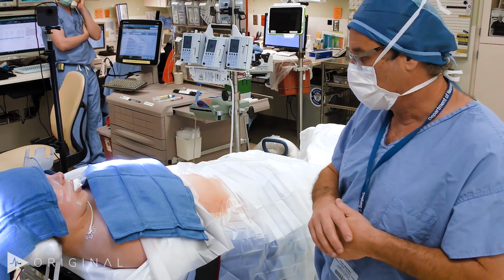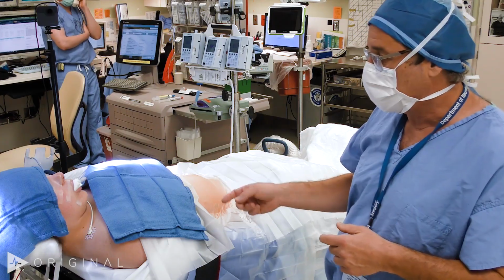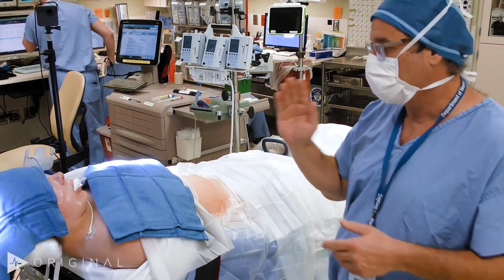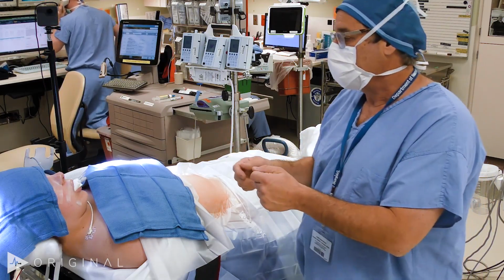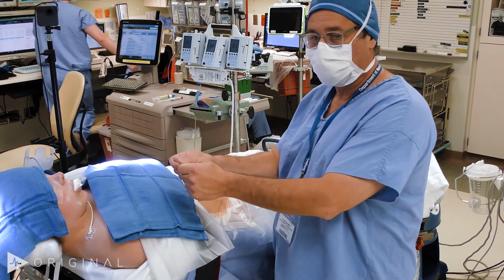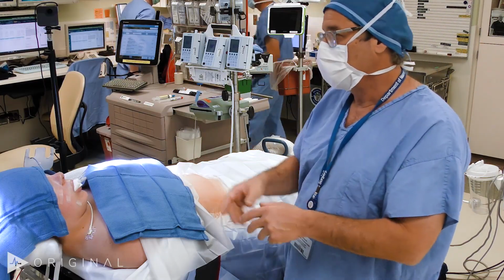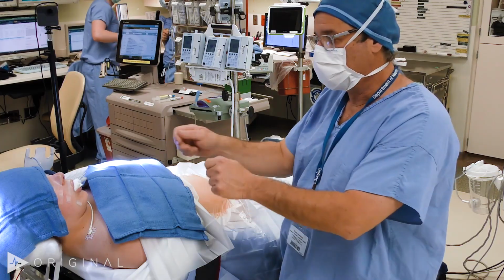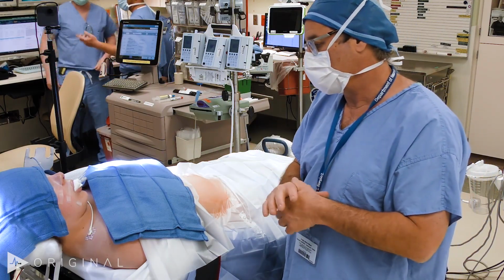The position for me is important. I like reverse Trendelenburg. The abdomen's been prepped out for some abdominal fat in case it's necessary. I like the bridge of the nose flat, parallel to the floor, pointed towards me about 30, 40 degrees so I don't have to torque and hurt my back. Feet straight to the other side of the room. And this gives a good working space for the ENT surgeon and myself to do what we need to do. We have the endoscopic monitor there, the operative microscope here, so whoever's working can see exactly what they want to see as they're performing the operation.